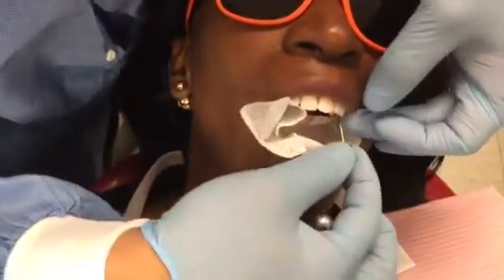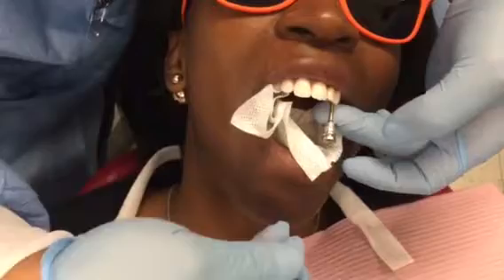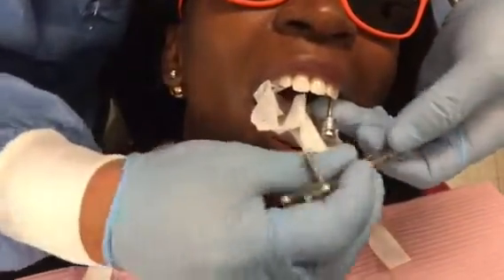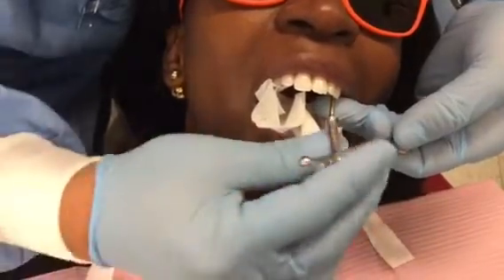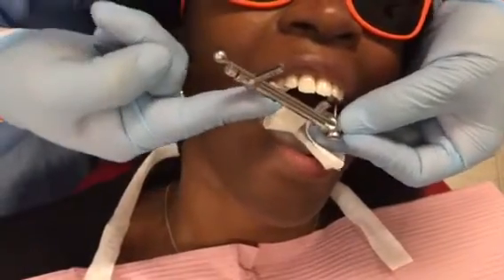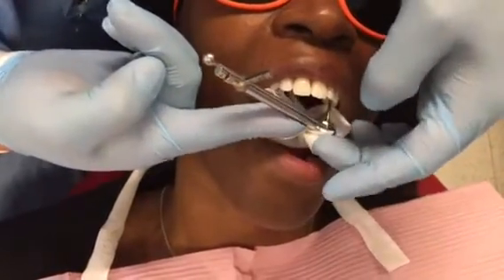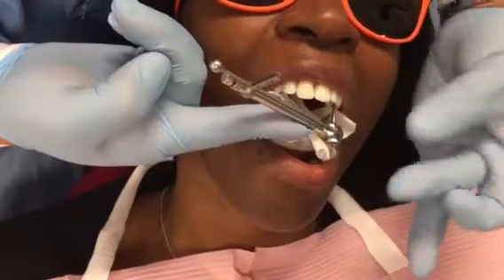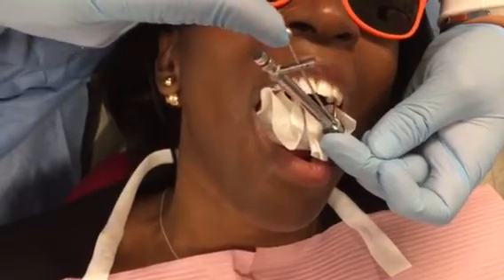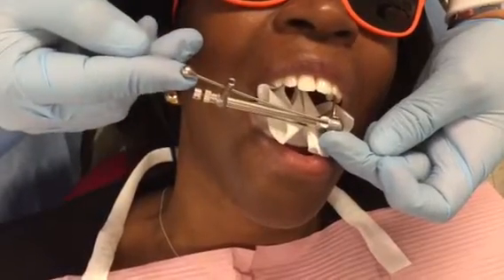So we're going to place this here. I'm going to feel the engagement — so it's engaged. Now I'm using this finger to hold this one, and I come to the top wrench with the letters up. Put this in like this and try to find some engagement. So at this point I engage. This finger right here is just going to stay there for holding. Now I use this finger to put my crown in, and all I do is this — one, two, three times.